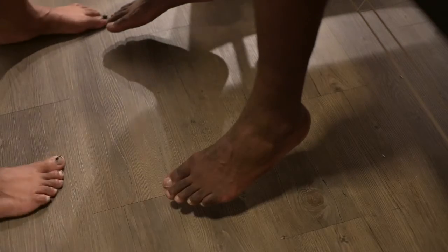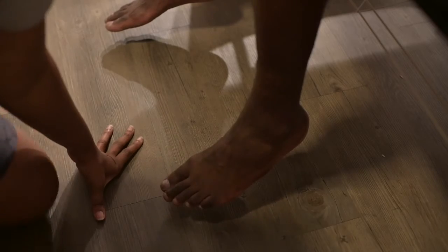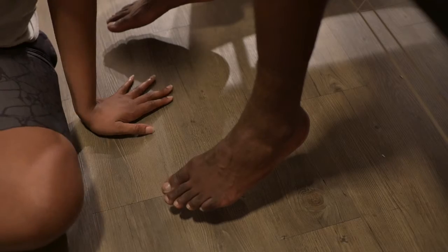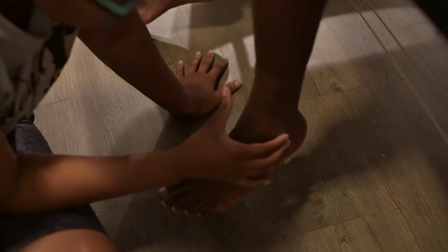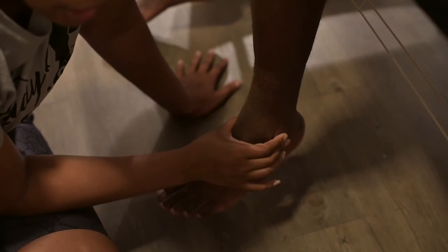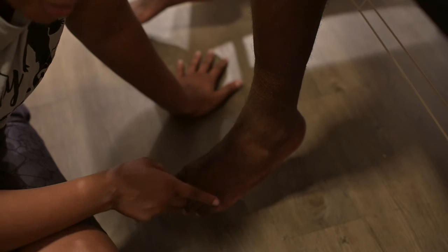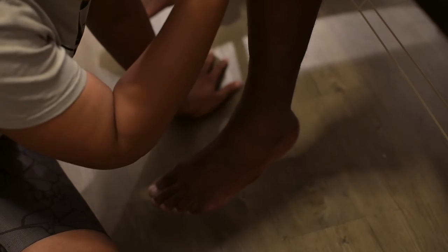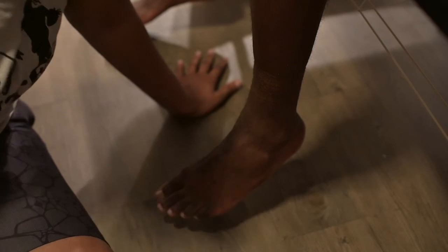All right, so I'm going to use this goniometer, the large one, and the areas that are palpable are the lateral malleolus. The other landmark is the 5th metatarsal, and the fibular head is another landmark that we will need to palpate for.